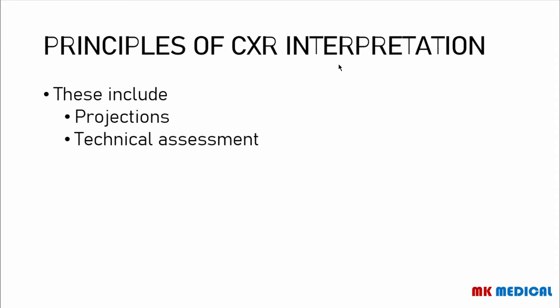And then what projection are you looking at? Meaning, in which direction were the X-rays traveling? Because this means different things in different scenarios. For example, if you're dealing with chest X-rays, there are some projections that you can order that are much more superior to others. We shall talk about them shortly. Then, of course, you should assess the technical quality of this X-ray, because if it is not taken very well, it can affect how you make a diagnosis based on it.